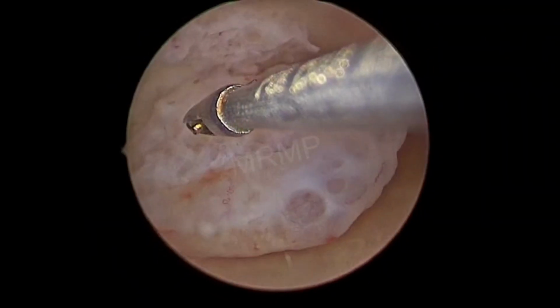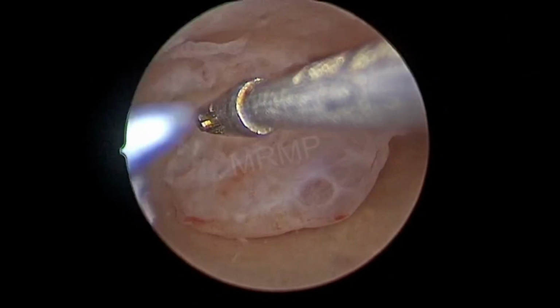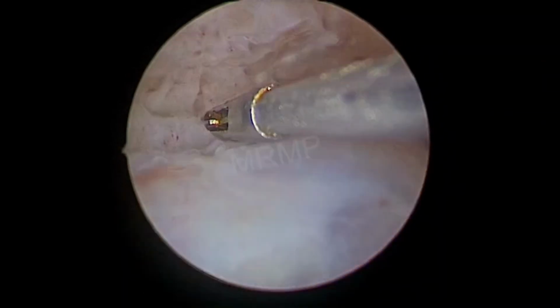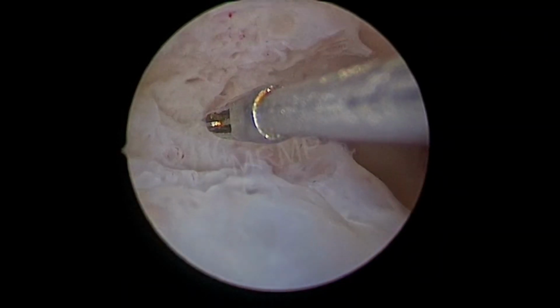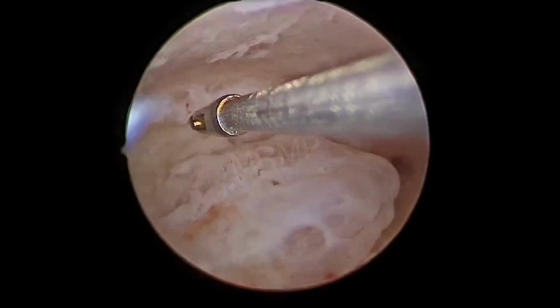Of course, it must be subjected to histopathology. The patient was an infertile patient, so this will be a blessing for her and almost the treatment for the cause of her infertility. We should avoid curettage, preserving the endometrial integrity, especially in infertile patients.